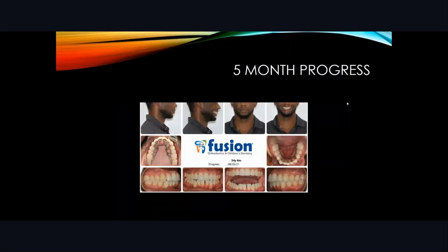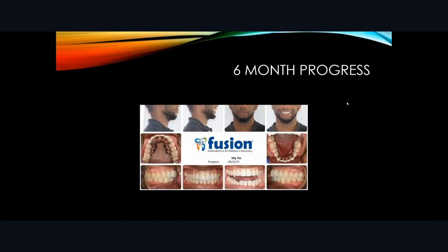5 months into treatment, space is almost closed. So we got some work to do. The upper crowding was resolved since the first month into the treatment, but I'm still holding them for the sake of the sagittal dimension and vertical dimension. At the same time, the bottoms are lining up, still have some curve of Spee left in the system and some residual spaces that require me to keep going.